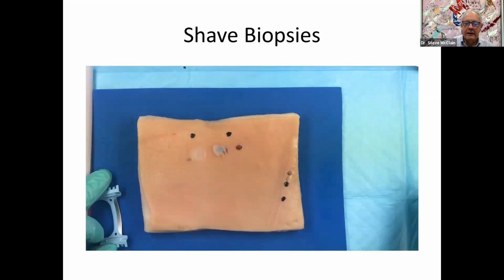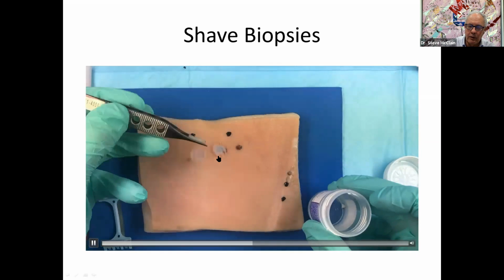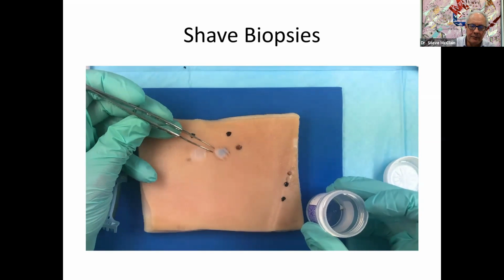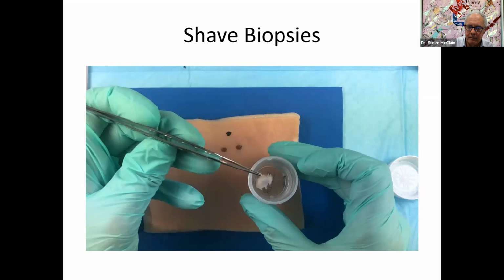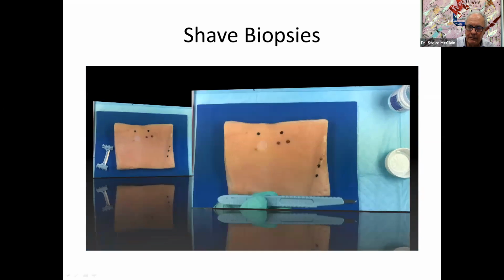And now he's going to pick it up with forceps, but you just do it by the edge. You don't want to squeeze it. You do not want to squeeze these biopsies. You'll ruin it. Drop it straight into the formalin and then label it.